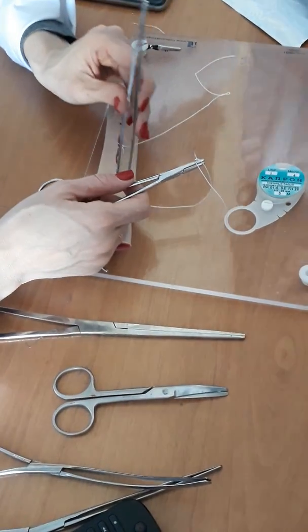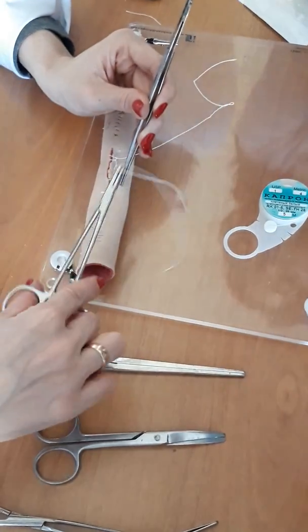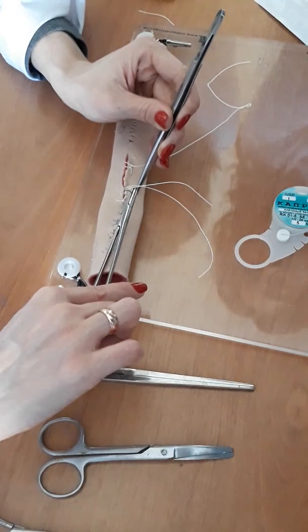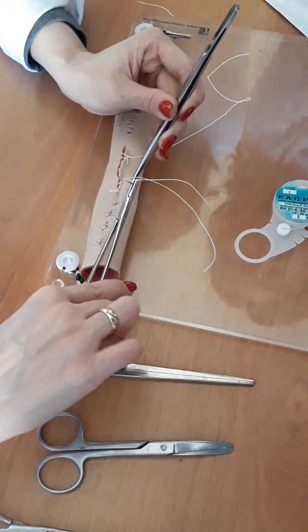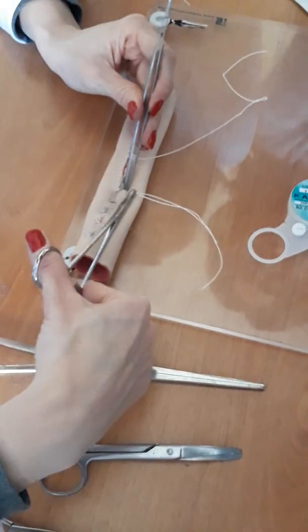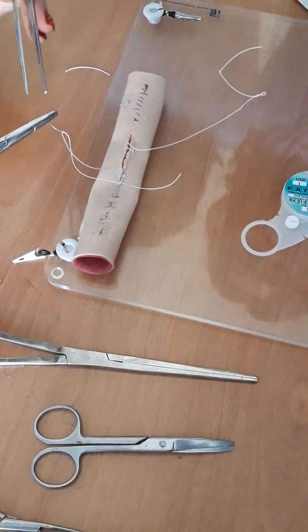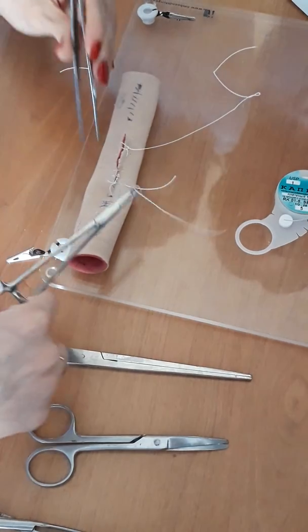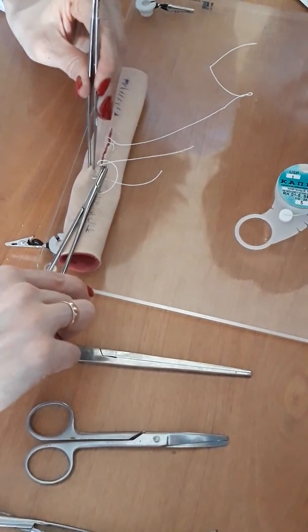What should you do? You should grab the wall of the intestine and step 5 millimeters from the first row. After that, pierce the serosa and muscle layers. Okay? Pierce on the one side. And here you should begin near this suture.